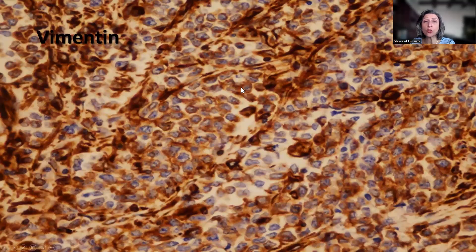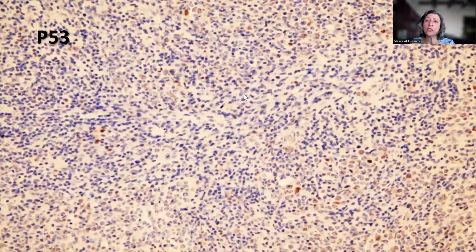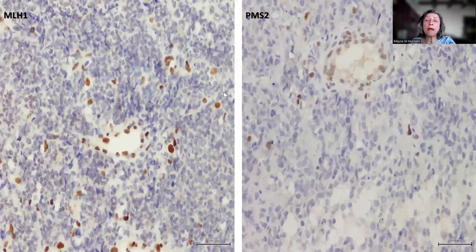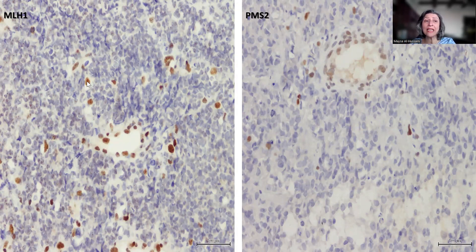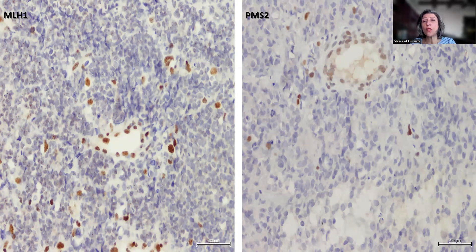Vimentin is usually strongly positive. P53 shows a mosaic non-mutant pattern of staining. With the mismatch repair protein immunostains, many cases of undifferentiated endometrial carcinomas — more than one-third — tend to show loss of nuclear staining for MLH1 and PMS2, but also sometimes for MSH6 and/or MSH2. This is an important support to the diagnosis because the other entities within the differential diagnosis tend to be negative.